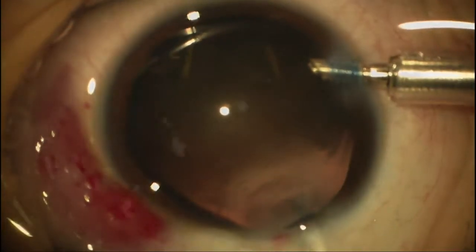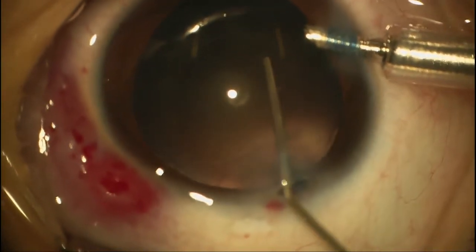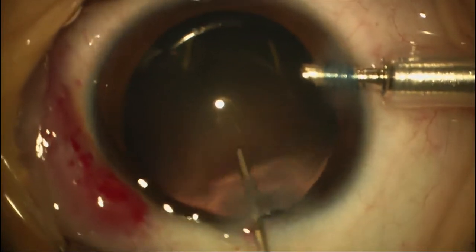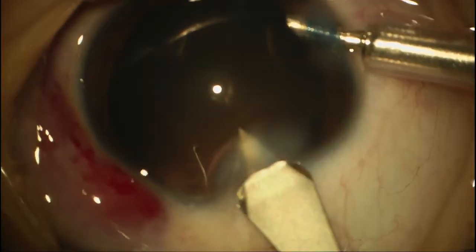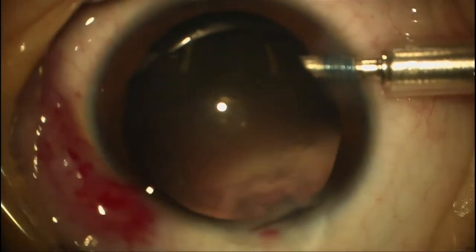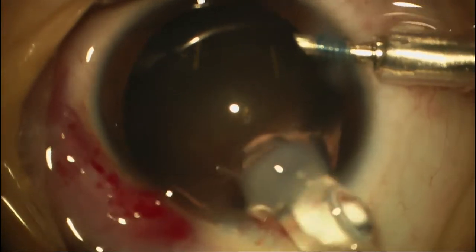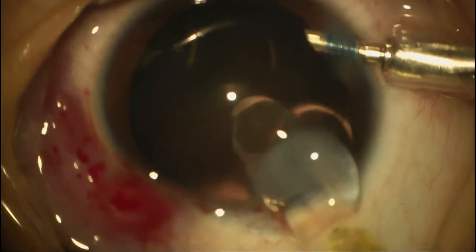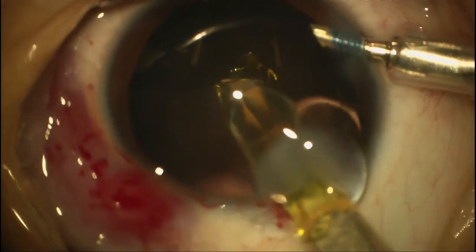At this point we're going to put the viscoelastic in and turn the infusion off. This is an Alcon SN60 — the same lens from the last case — that monoblock design. This is a plus 26 that we're using. This young lady is a little bit older than the last patient — she's five. At five years old, you figure you probably have about a year until the capsule opacifies, so she probably can cooperate with the YAG laser later if needed.